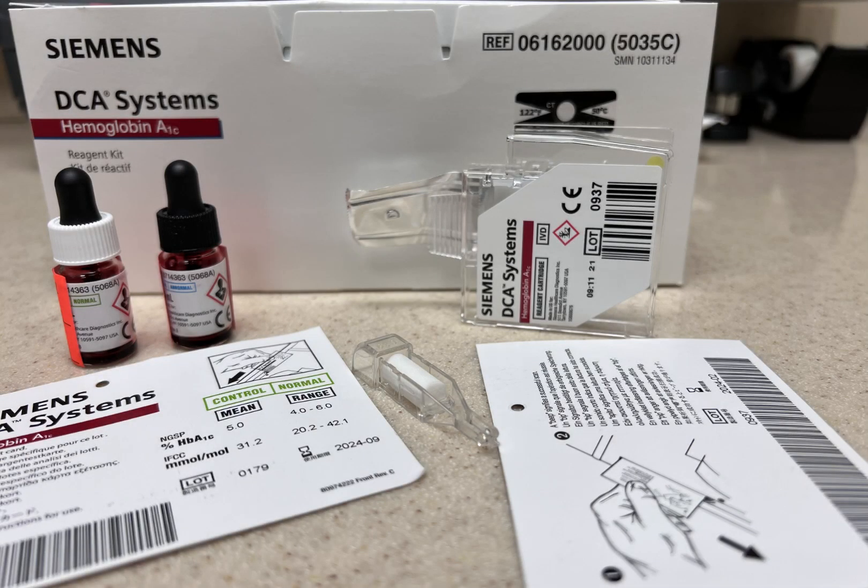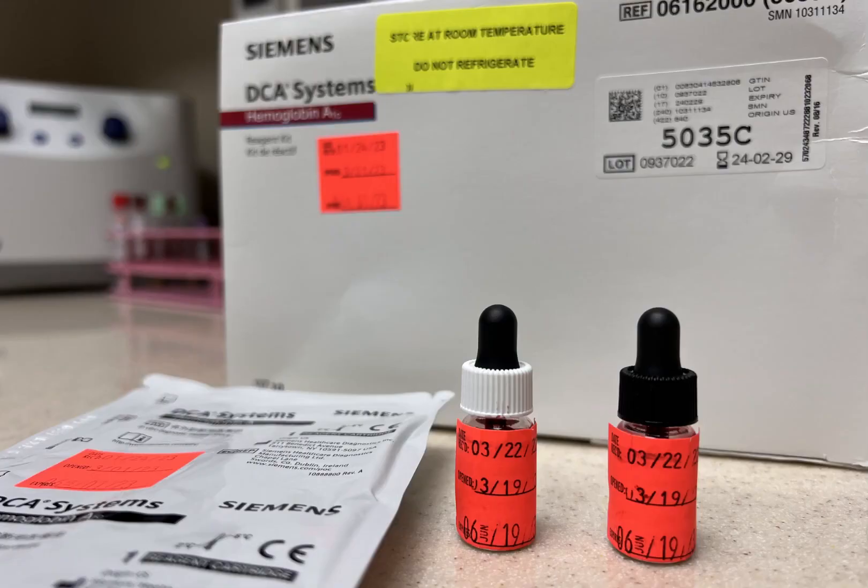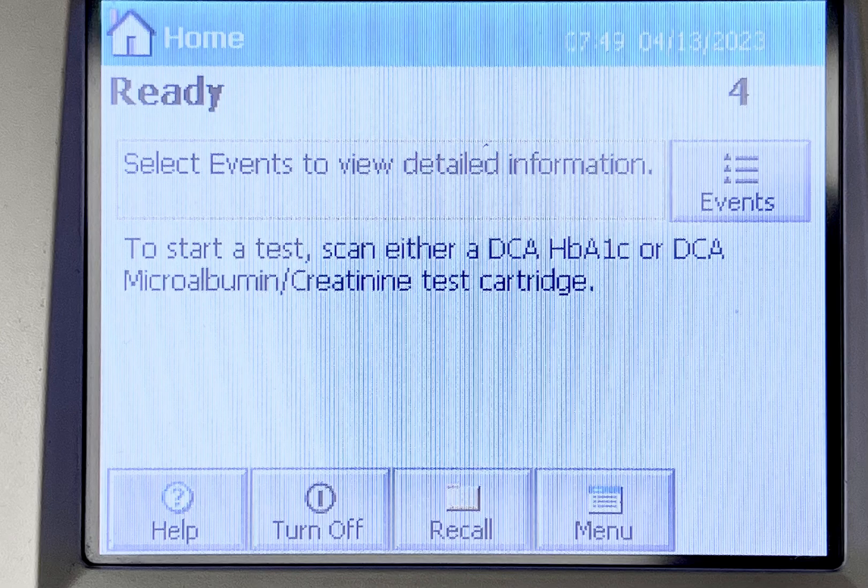How to QC hemoglobin A1C. Check the expiration date on the hemoglobin A1C controls and cartridge. Check the hemoglobin A1C meter for readiness.